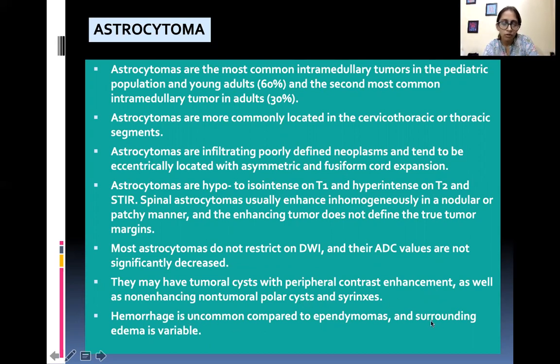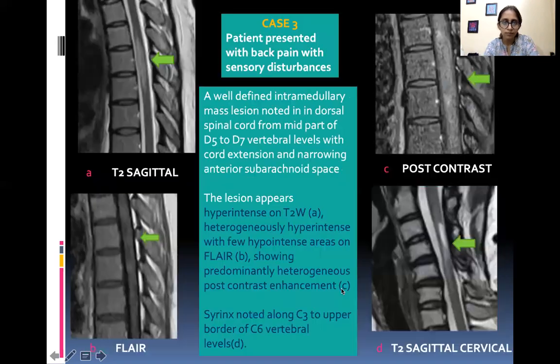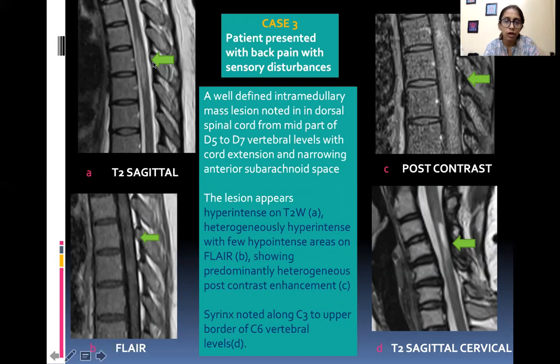Hemorrhage is uncommon in astrocytomas compared to ependymomas. Presenting a case of astrocytoma: patient presented with back pain and sensory disturbances. A well-defined intramedullary mass lesion is noted in the dorsal spinal cord from mid D5 to D7 vertebral levels with cord expansion and narrowing of the anterior subarachnoid space. The lesion appears hyper intense on T2, heterogeneously hyper intense on FLAIR, and shows heterogeneous post-contrast enhancement. Syrinx is also noted along C3 to upper border of C6.